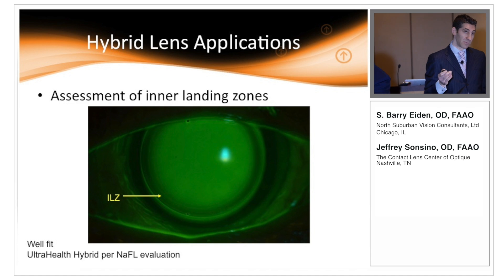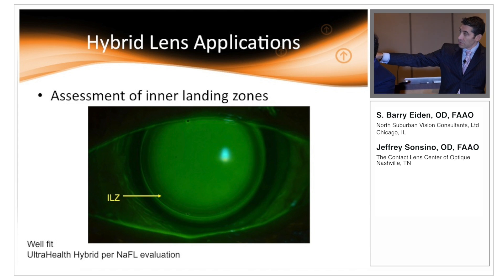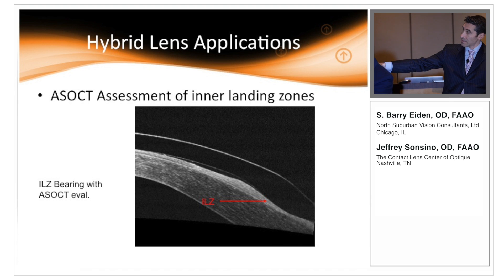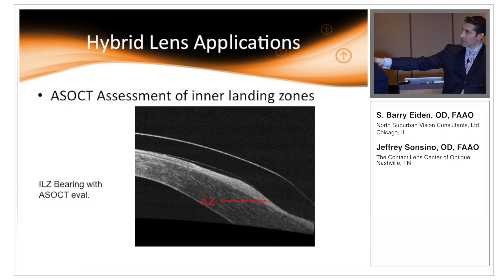One of the great ways to use anterior segment OCT with hybrids is to assess the inner landing zones. You can see this on fluorescein evaluation — as we get into the inner landing zone, the area contacting the mid-peripheral cornea, the fluorescein dims indicating the lens is getting closer to the cornea. With anterior segment OCT you can actually image this and confirm you're just gently landing rather than bearing. Here's an example where the inner landing zone is bearing too greatly — you can see the distortion of the cornea and the compression of that zone.